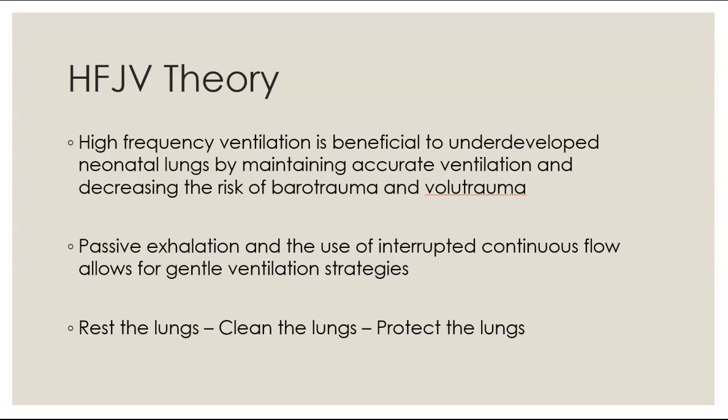Okay, so theory. The high-frequency jet ventilator is beneficial to underdeveloped neonatal lungs by maintaining accurate ventilation and decreasing the risk of barotrauma and volume trauma. Essentially, it is a gentle form of positive pressure ventilation for immature alveoli.